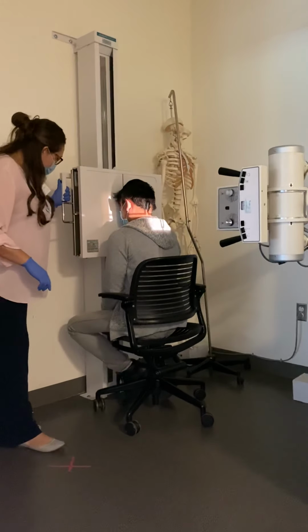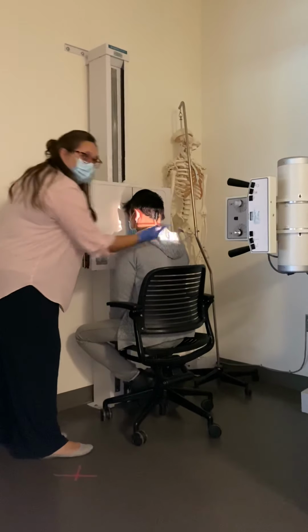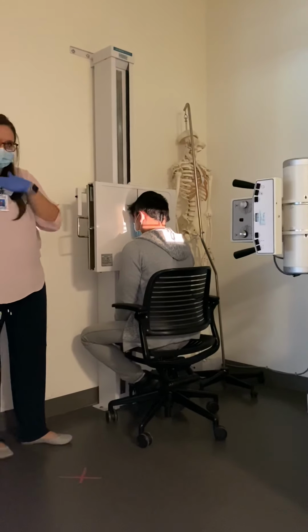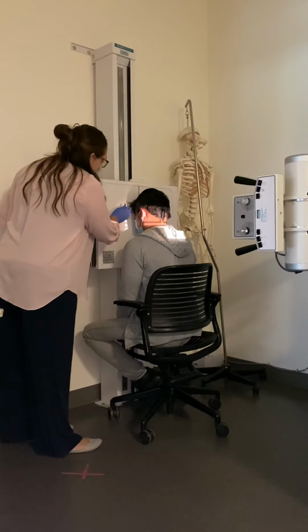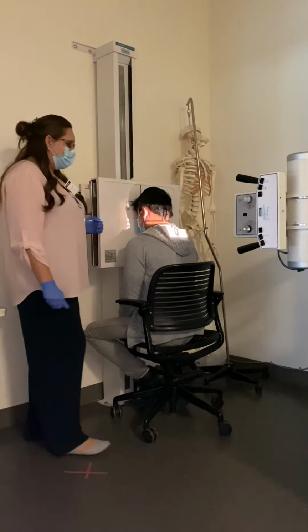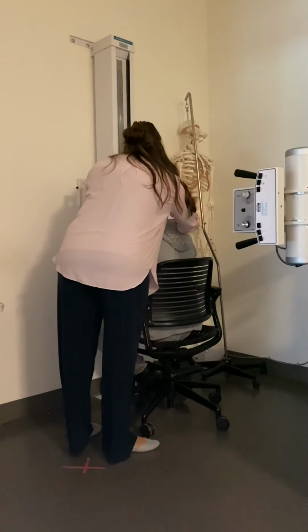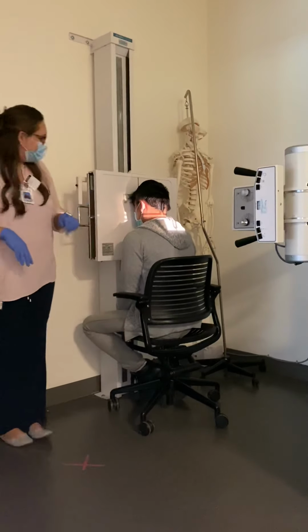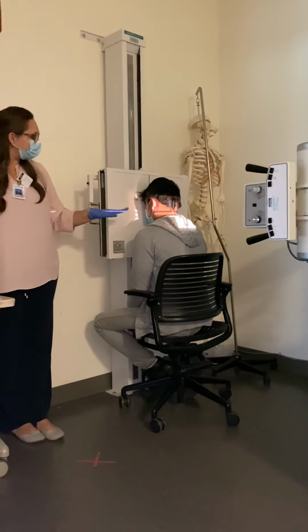This board's going to lower down in front of you. It looks a little bit low down here. If you can see, the bottom of our light is coming down into the back. That's fine, because when we tip the chin down, that brings the mandible down a little bit, so we can still visualize that. We should have light above the EAM, or to about the top of the ear. And then I just need to double check and make sure that there's no rotation and that I'm centered to that mid-sagittal plane. So that's just the straight PA with the central ray perpendicular.